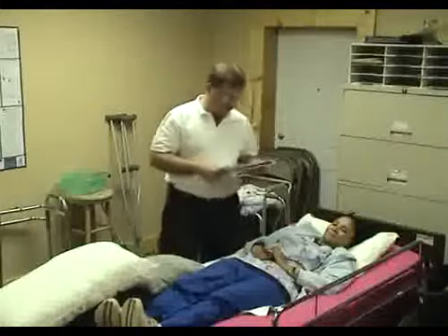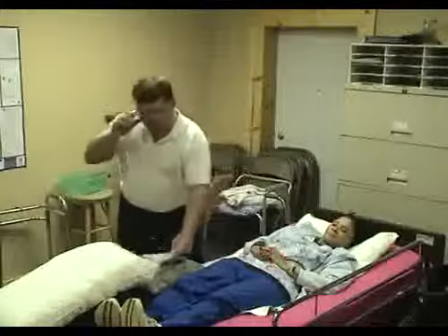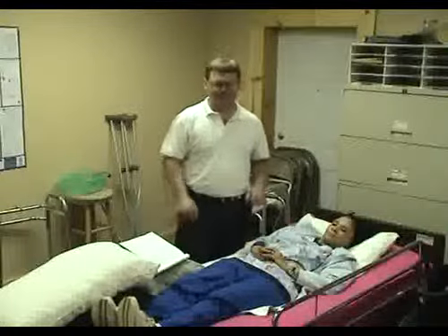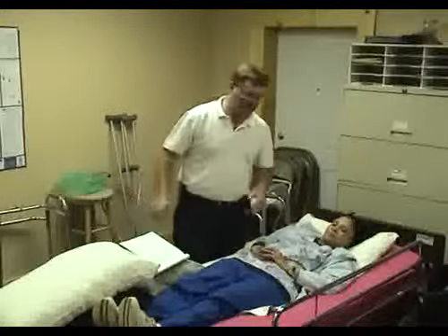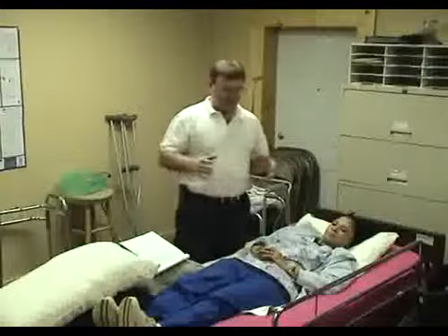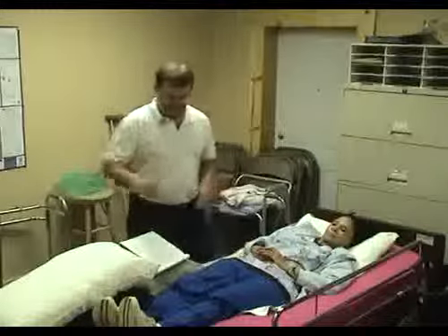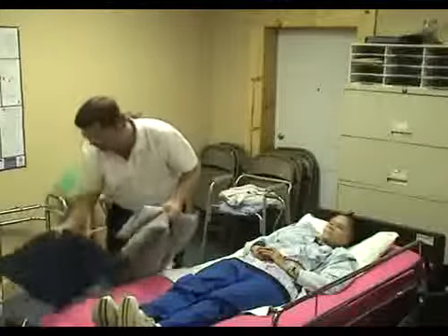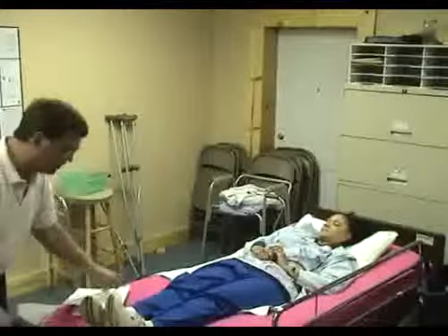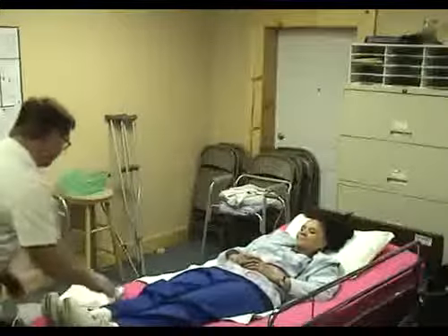Reposition the client to move up in bed or to turn on side, assuring correct body alignment to the extent possible. What they're saying is try and keep them straight. You know, I mean, if you got the feet hanging out over here, and the head's hanging out over here, and the rear end's over that way, just try to keep the center of your spine in a straight line. Now, I had mentioned earlier how to pull up someone in bed. It's real easy. Whenever they've slid down too far, and I'm going to slide you down just a little bit. Good. So your feet's hitting the rail.